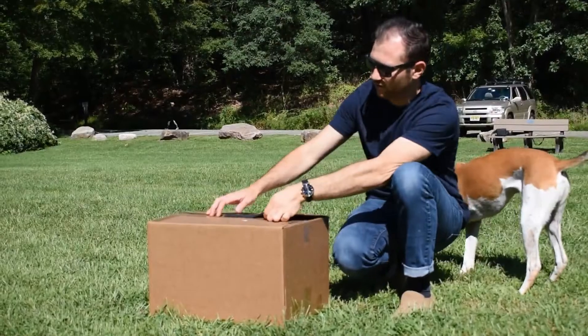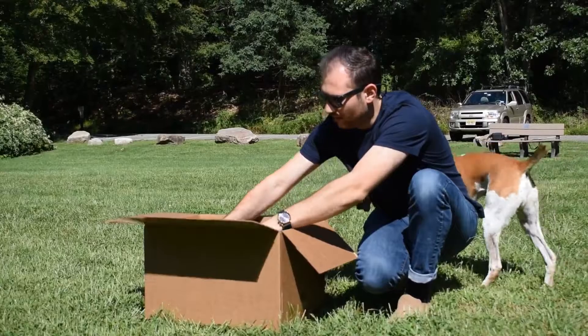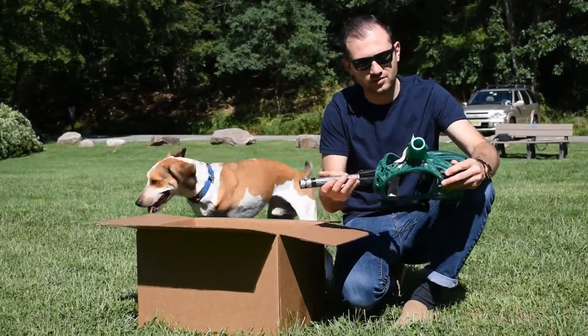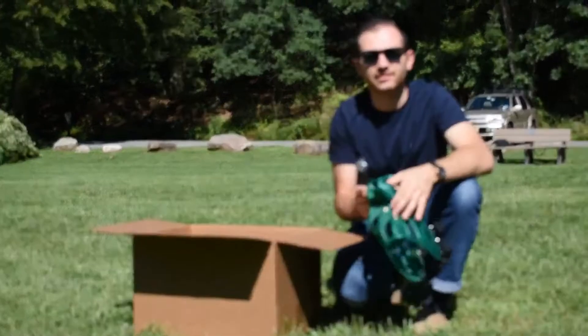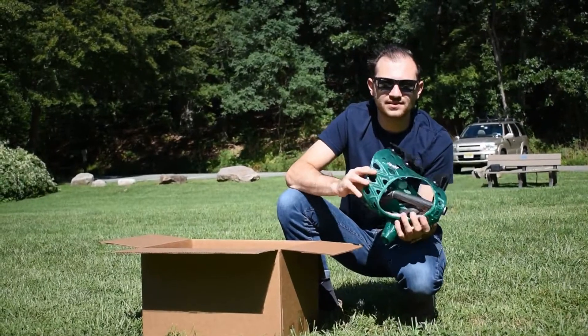Without further ado, open up the box that you will receive. We're going to pull out the prosthetic, which will be wrapped, but this is what it'll look like. Every prosthetic is a little bit different and we'll talk about that a little bit later.